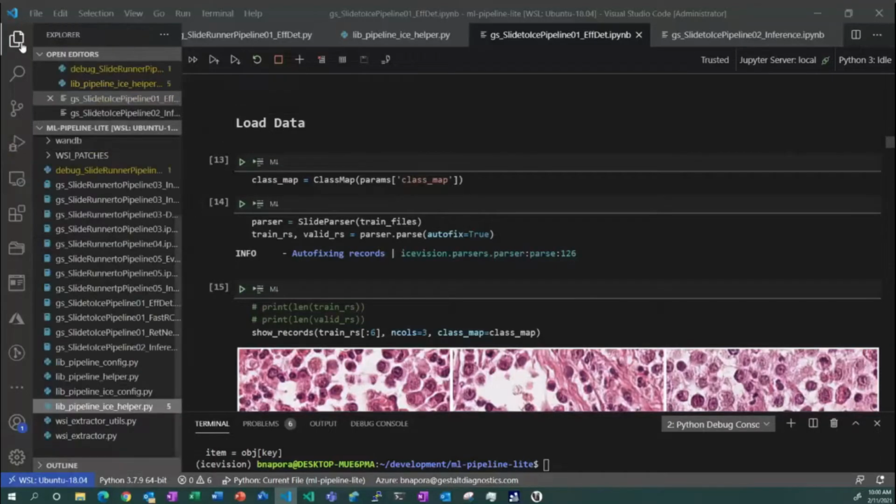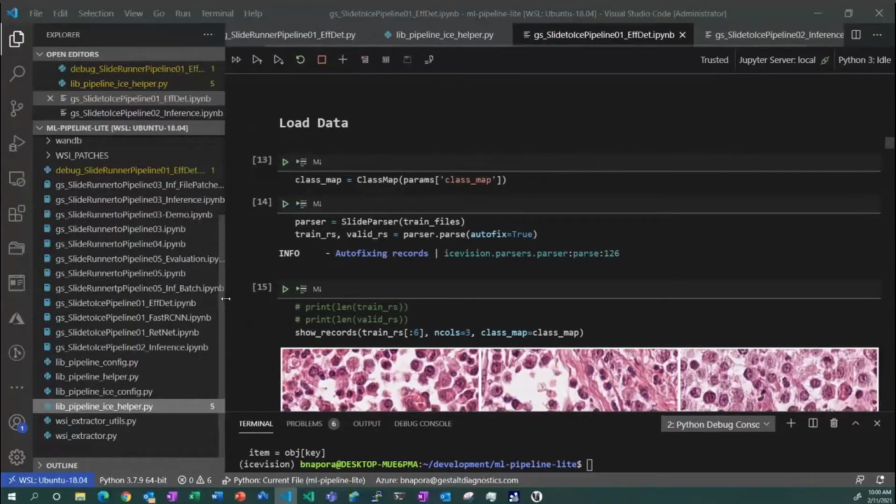I've done a number of experiments running different backbones as a result, and one of the fantastic aspects of IceVision is this flexibility. Currently getting best results with EfficientDet, but also run faster-rcnn and then a RetinaNet pipeline as well. Looking forward to experimenting as we add additional backbones into the framework.